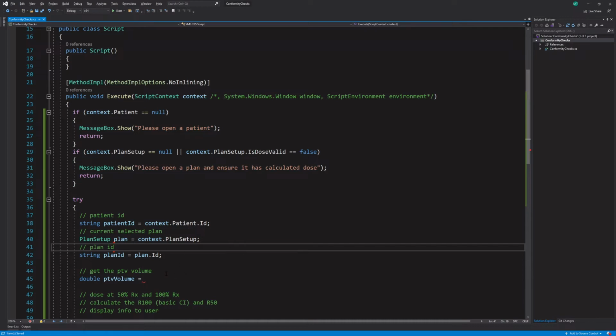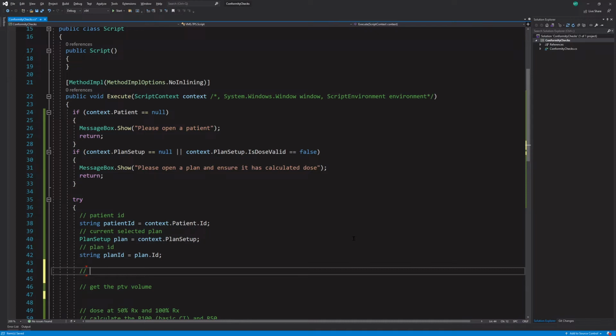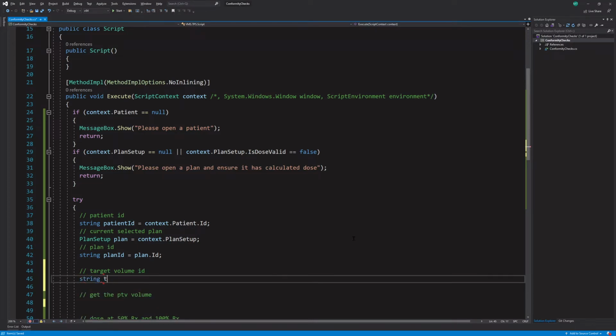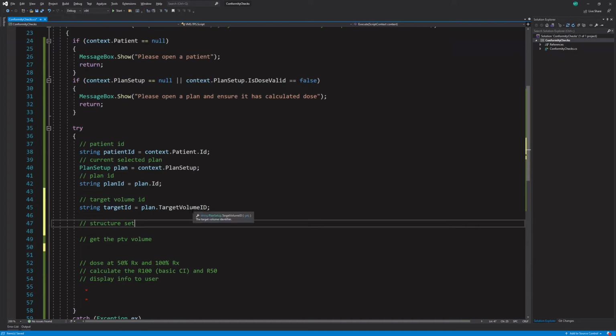Let's do plan dot. Let's see if there's a target volume ID. Okay, that's the target volume ID. I think I'll do this in a bunch of steps so that you can see. Let's get the target volume ID. So we'll say string targetID equals plan dot, let's see, what was it? plan.TargetVolumeID. And then let's get the target. We want to get the target from the structure set. Like I said, I'm going to do this in a bunch of steps so that you can see how each of these is done.